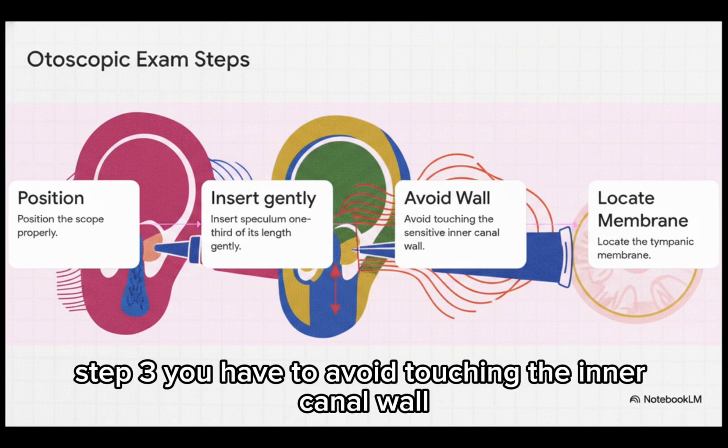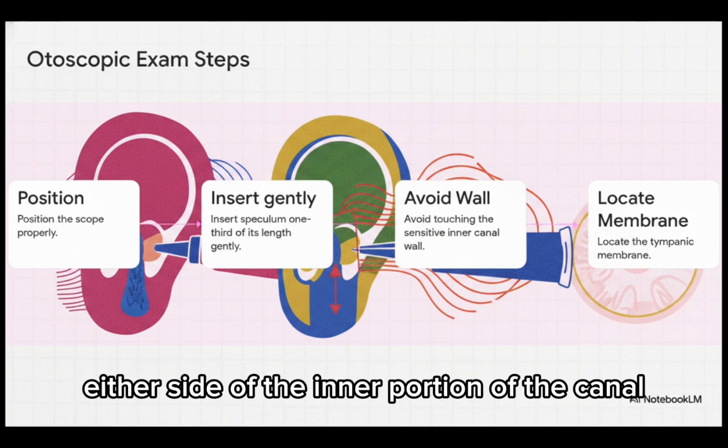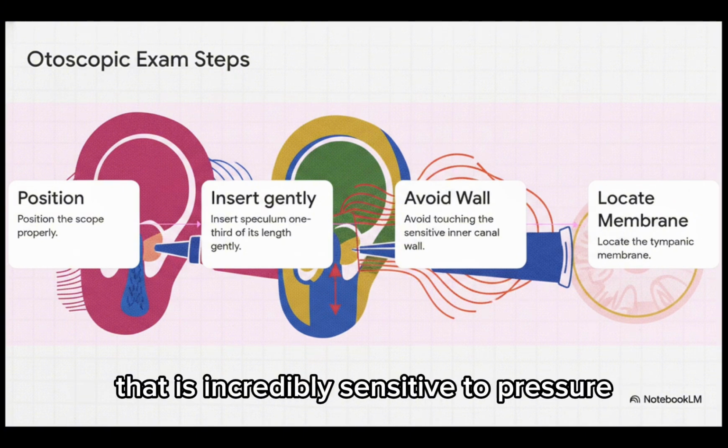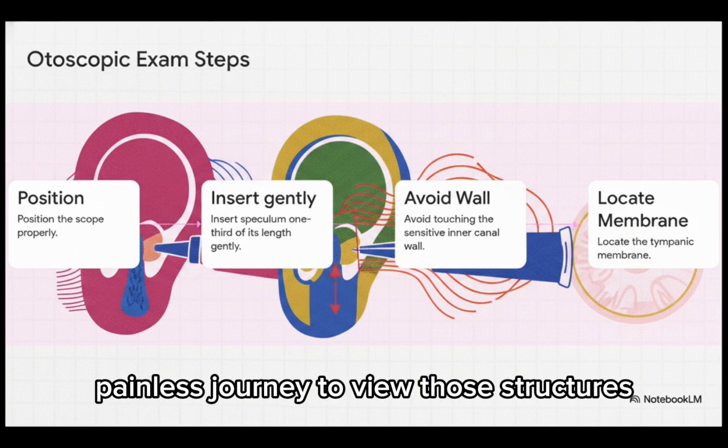You have to avoid touching the inner canal wall. You have to be exceptionally careful not to touch either side of the inner portion of the canal because, let me tell you, it's covered by a thin epithelial layer that is incredibly sensitive to pressure. The goal here is a smooth, painless journey to view those structures.